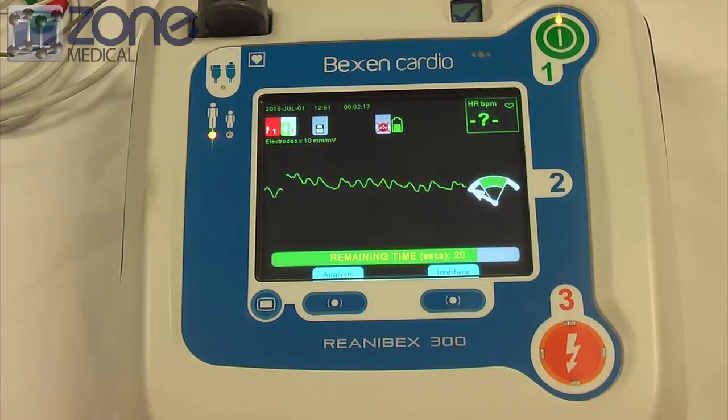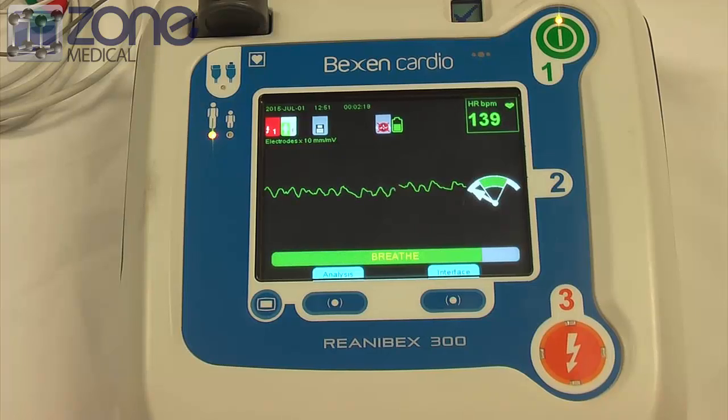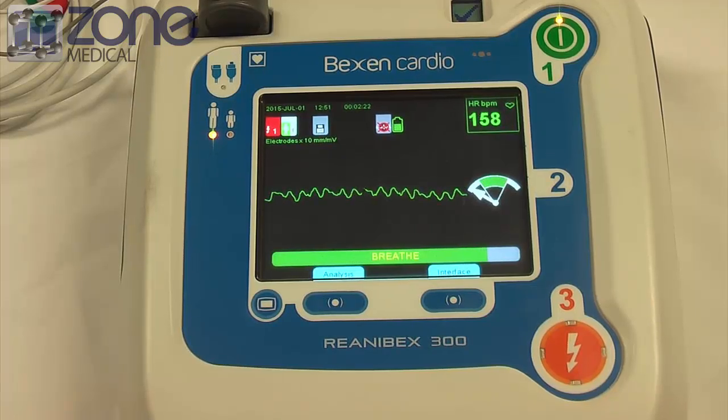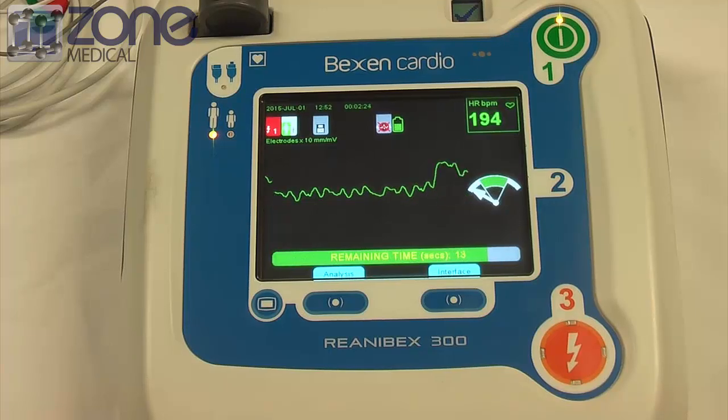Stop compressions. Breathe. Breathe. Continue with compressions.